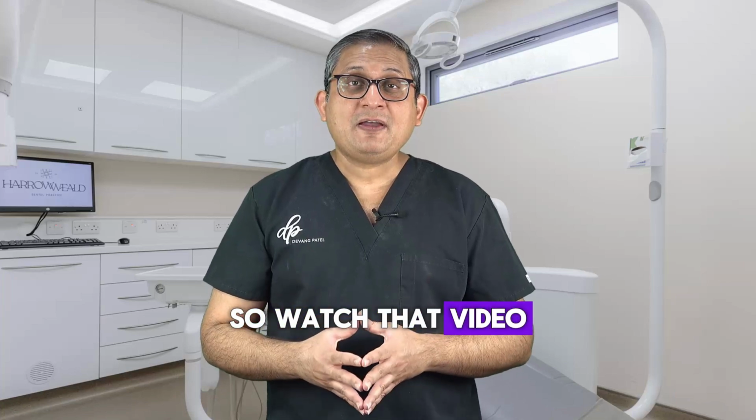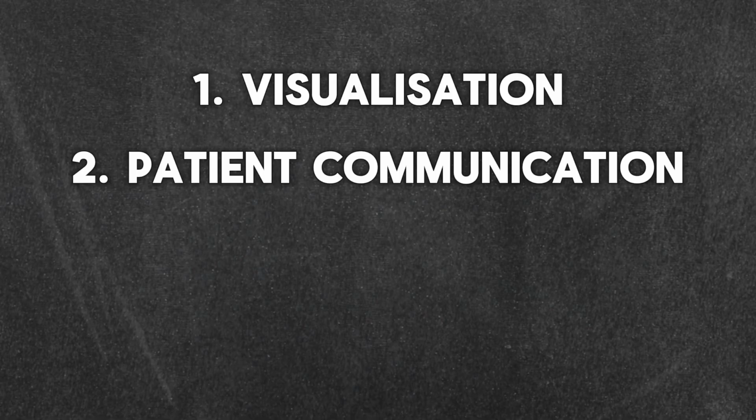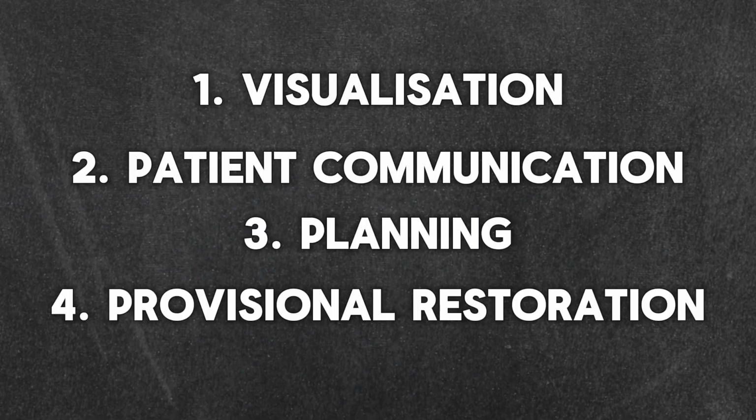So watch that video. But these are the 4 reasons why you should consider a diagnostic wax-up: visualization, communication with the patient, treatment planning, and provisional restorations.